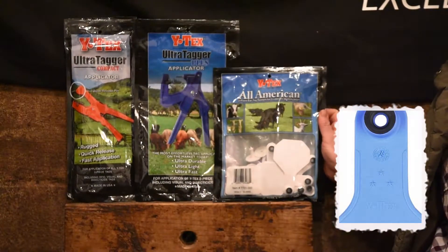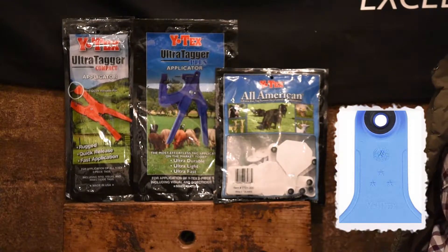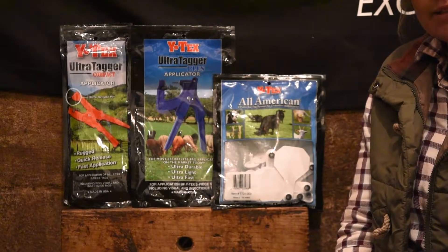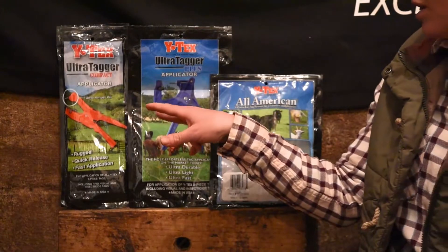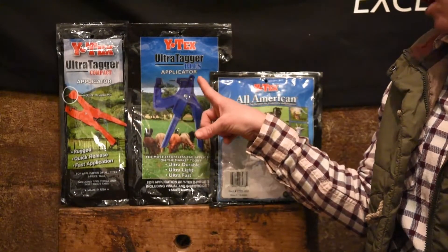Our calf tag size is 3-star, so you'll want to look for the 3-star symbol on the neck of the tag. And then it's very important to use the correct tagger with the tag that you're using. Same tag, same brand tagger. So if we're using All-American tags, we want to use the Y-Tex Ultra Tagger Compact or the Y-Tex Ultra Tagger Plus.